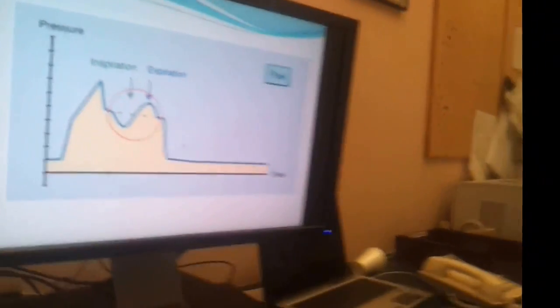Okay? In emergency, I've seen it more than many times, that if the ventilator is alarming due to pressures and the patient's actually showing these undulations, it's hugely difficult to just keep increasing sedation and trying to overcome a young man's breathing stimulus. It's probably best to decrease the sedation so that they can breathe up enough to maintain their breathing patterns and to maintain their oxygenation and CO2.